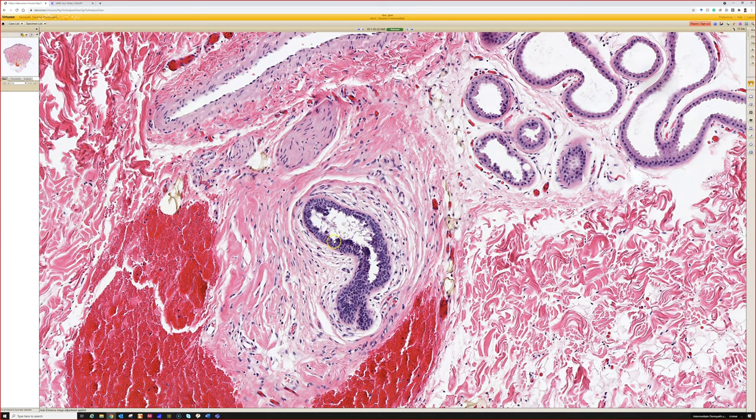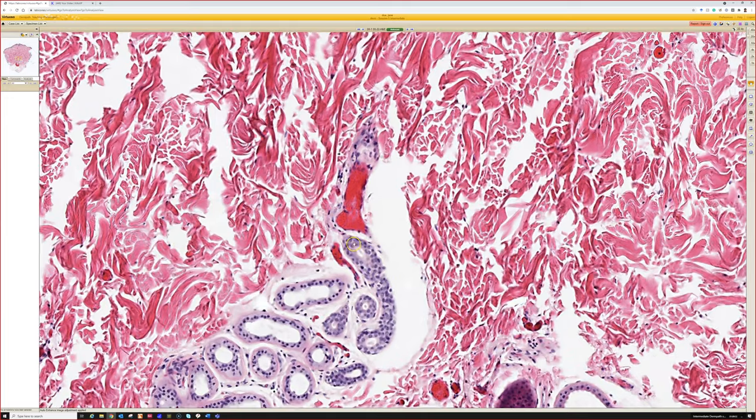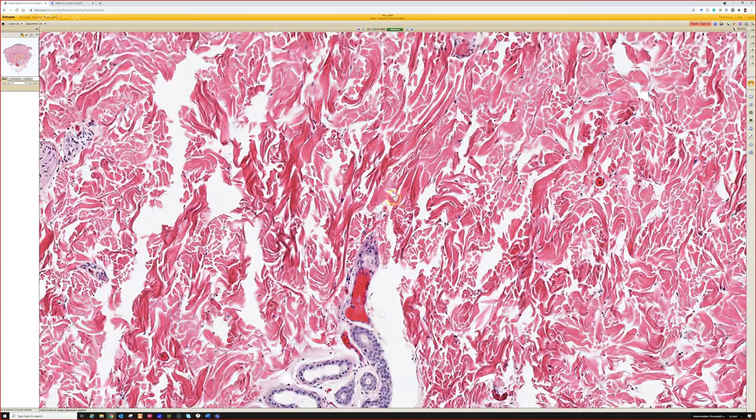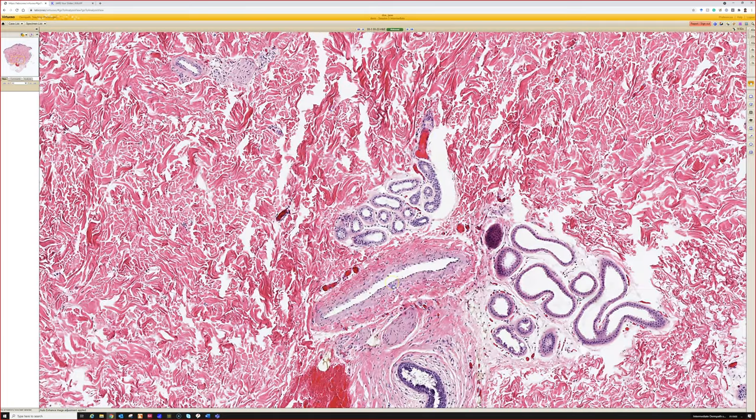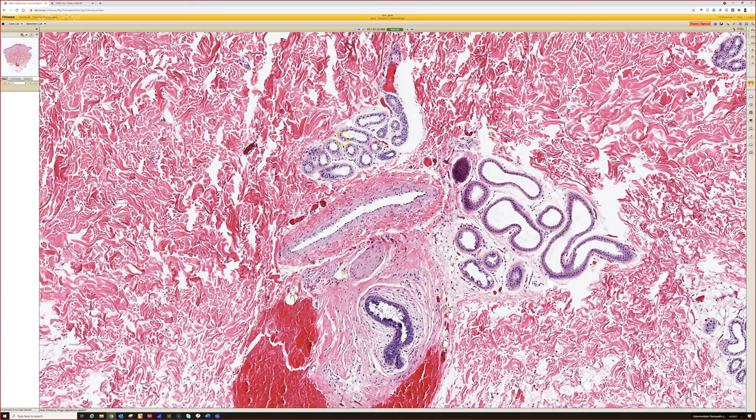That's like the nipple duct lining has that look, as opposed to say a sweat duct, which is a little bit more clean and not as columnar and not as shaggy on the surface. It's more like a tight layer. I don't know if I'm describing that right, but these are usually darker blue. So sometimes it's hard at first to recognize how we know that's a nipple duct, but it looks different. If you study and compare, this is a nice slide because you can contrast apocrine, eccrine, and nipple duct.